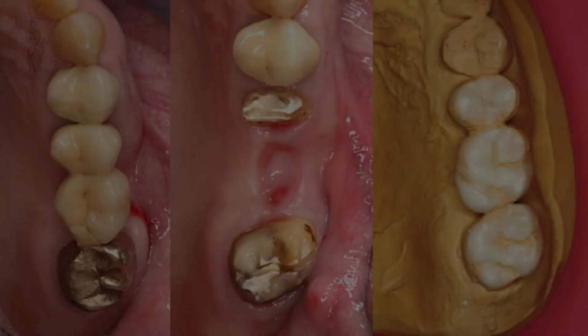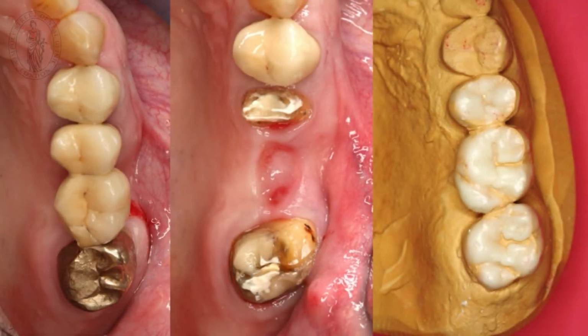So the first step which we do is that we remove the old bridge, see what's underneath, and you can see here from left to right the old bridge on the left, then the bridge taken off. You just slice the ceramic and the metal framework lying underneath, bend it a little bit, and then you can easily take it off. And on the right side you see a stone plaster model taken from the situation before, and then the dental technician just adds a little bit of wax to adjust for form and shape of the existing bridge, so that we can prepare an ideal temporary already and that the patient can test the situation.